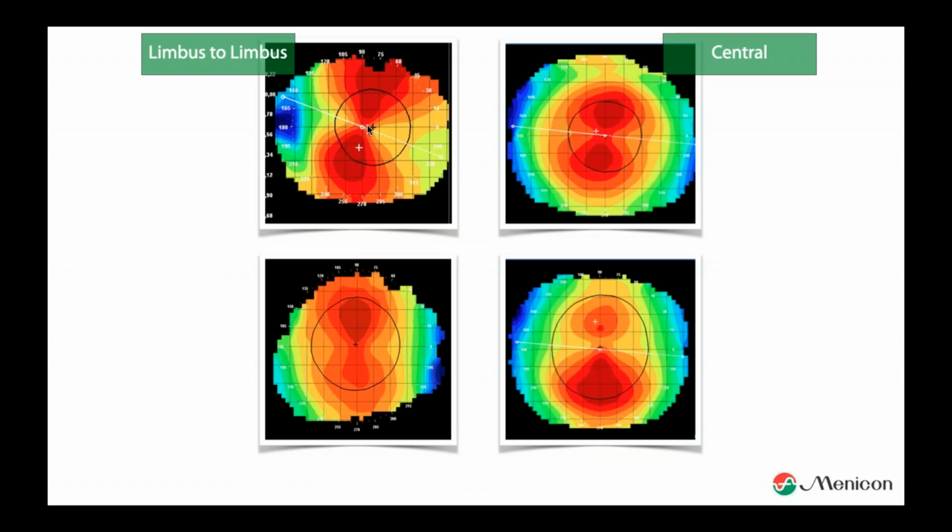If the center astigmatism is the same and you keep it with a normal spherical lens, probably you end up with a good fit. But here it will be decentered, it will not function properly, because it actually fits in the periphery, so behavior will be different. So, very important stuff. We don't cover it any further today, but for other lectures it may be interesting to go into.